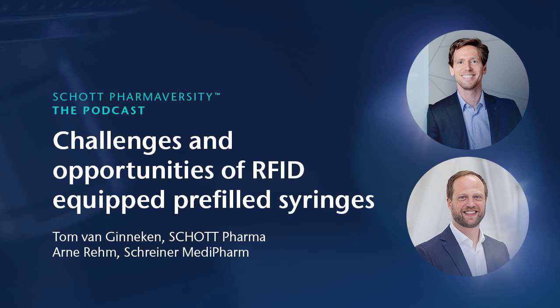So for now, there's one additional aspect. There are different systems available on the market using different data structures and approaches. For example, some rely on all data being encoded into the tag itself. So not only the product identifier, but also expiration date and lot information is stored directly in the tag, which is possible with RFID.